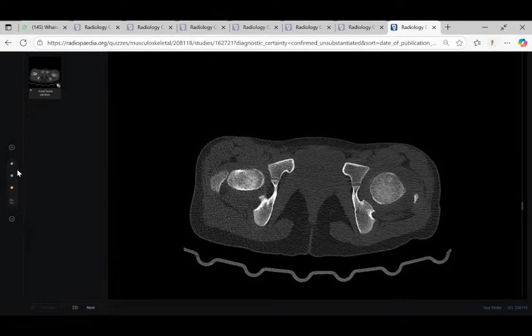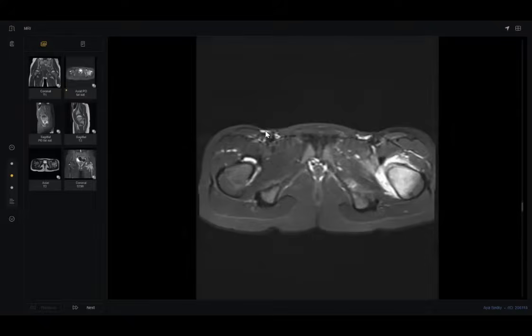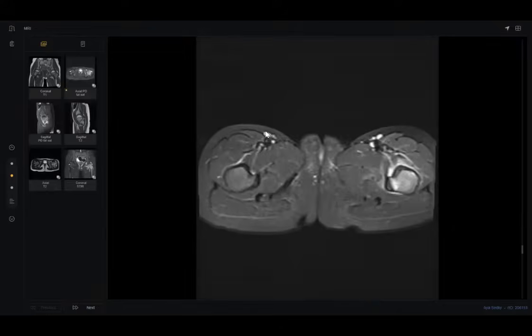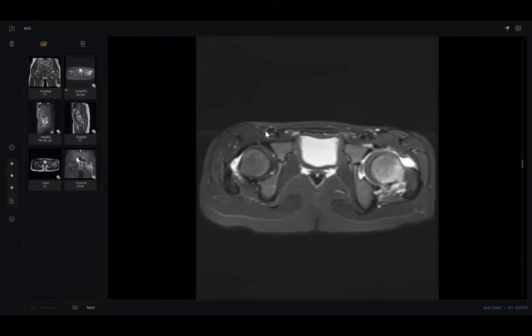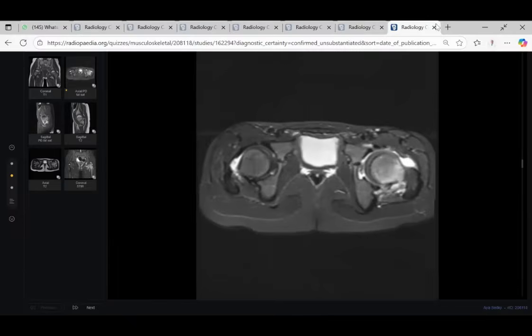For other differential diagnoses, at least you can tell the examiner, doctor, at least if you didn't see it from here, you can see there are effusion and edema. So my differential, number one, transient synovitis. Number two, septic arthritis, but here you need contrast to rule out any abscess formation. Number three, I should search for osteoid osteoma. Thank you, doctor, so much. Next candidate.